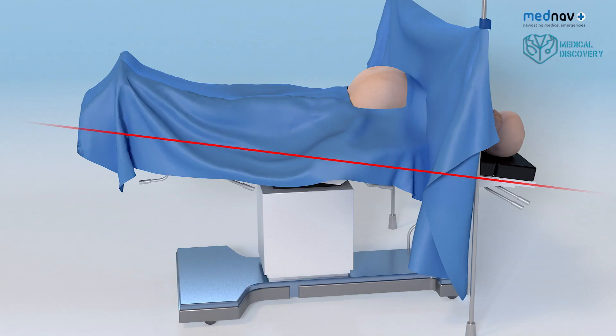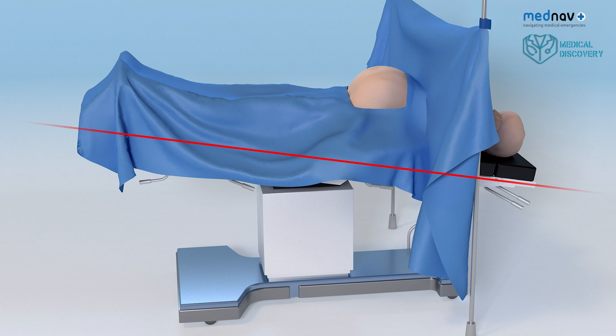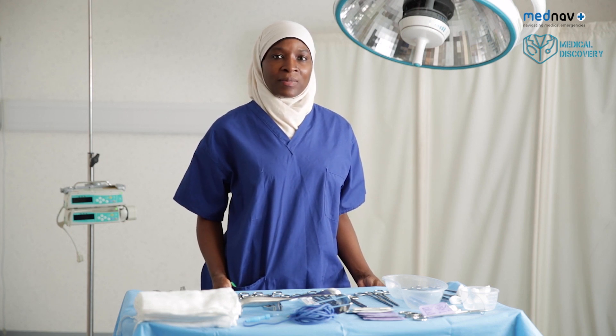Head down. Ask your anaesthetist to lower the patient's head as much as possible. Ask your anaesthetic colleague to give a tocolytic such as GTN, salbutamol, or terbutaline.